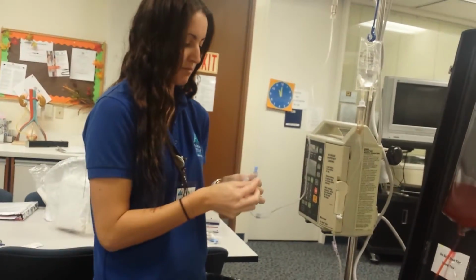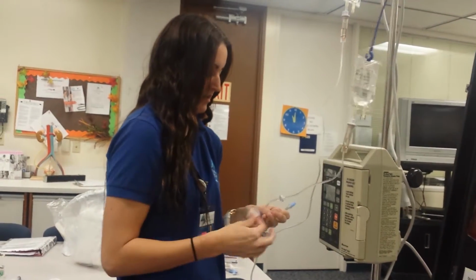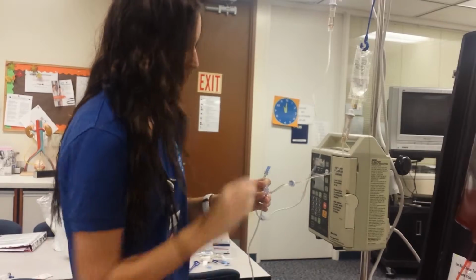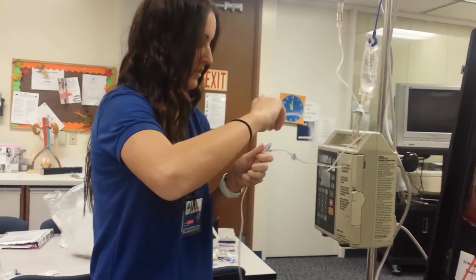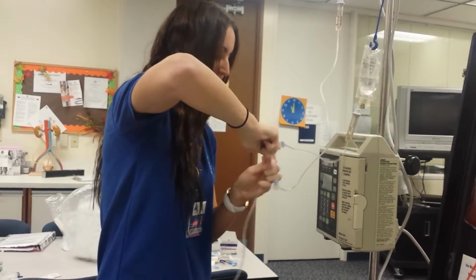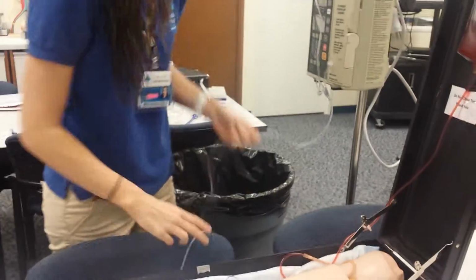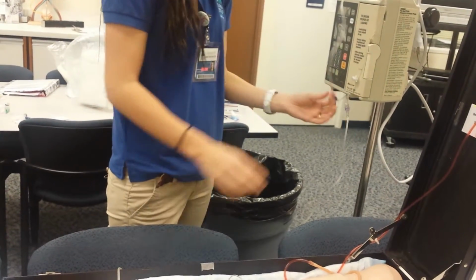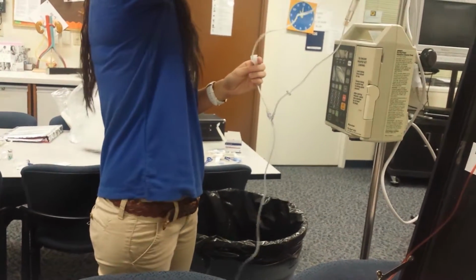I'm going to cleanse a port on my primary. It's right here. And if this were already uncapped, I would cleanse this. Attach it here. And since the clamp on the primary is below the secondary, we're not going to clamp it, or secondary won't run either. We're going to unclamp the secondary tubing and observe here for our drips.